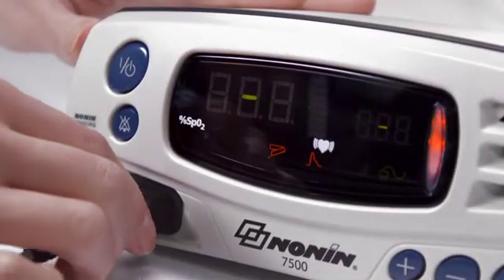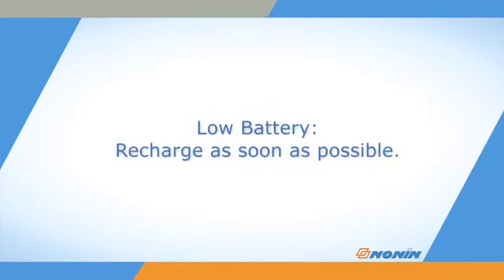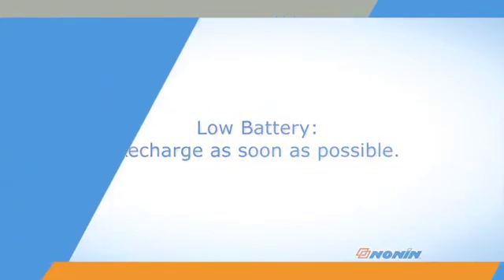Recheck the sensor connection to the oximeter. The low battery indicator will blink when the battery is getting low and stay on continuously when critically low. Recharge the battery as soon as possible.